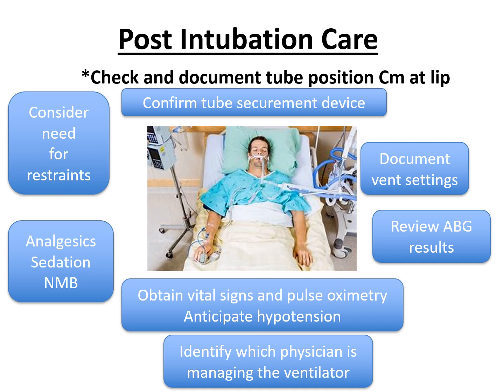So once the patient has been intubated, there are a few things that you need to do. One of the first and foremost is to find out which physician is managing the ventilator, especially if a patient came back post-op. The surgeons want nothing to do with the ventilator. The anesthesia department is done after they've moved the patient out of the OR and the patient has been recovered. So it is important to find out who will be managing the vent orders. They will be making vent changes, and they will be giving the orders for the first settings.